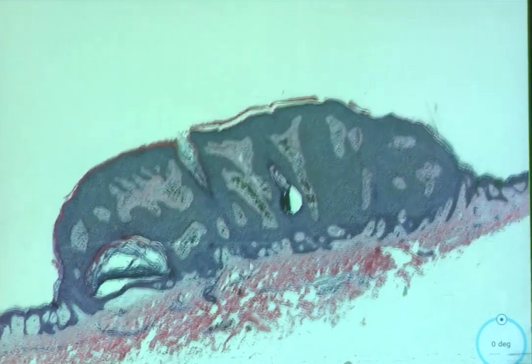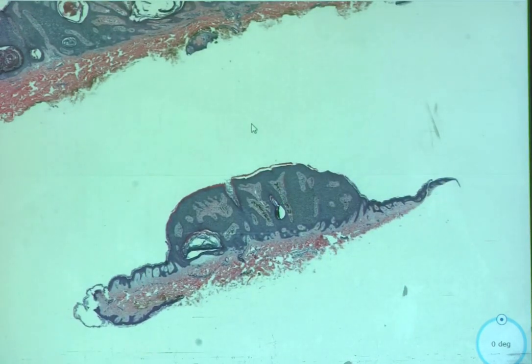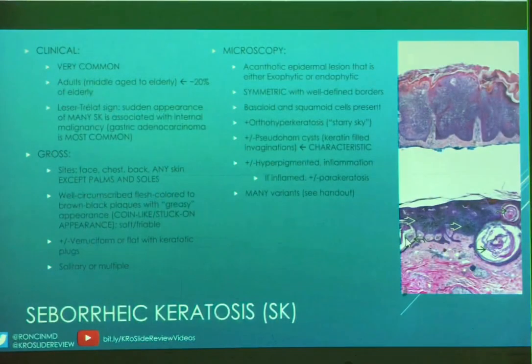And then we got to check the other piece, which is very much the same thing. I have to be a good pathologist. I have to check both pieces. And right, we have to check the other profile, technically, but we're going to just skip that for the sake of time. Yeah, anyone who watched the challenge case review that I did earlier this week is going, wait, for the most part she looked at one piece, yes, in the interest of time, but to be a good pathologist, look at everything. So these are incredibly common.